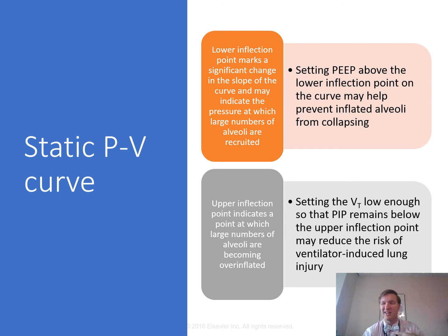In some ventilators, I think the Hamilton has a version of this. I don't get paid by any of the vent companies. For obtaining a static PV curve, currently they're equipped with computer software and graphic displays that can automatically generate a PV loop, save a reference loop, and make comparisons over time. Ventilator graphics have really helped over time. A lot of people do a daily evaluation of the pressure-volume loop, whether it's static or dynamic, to track the progression of lung compliance and Raw changes.